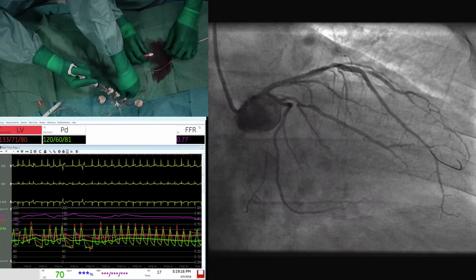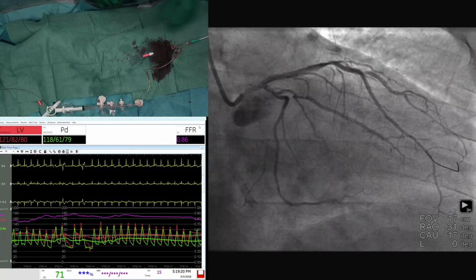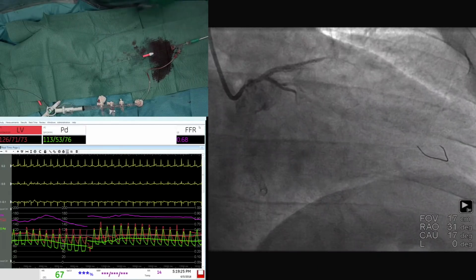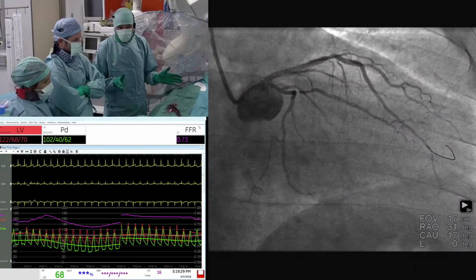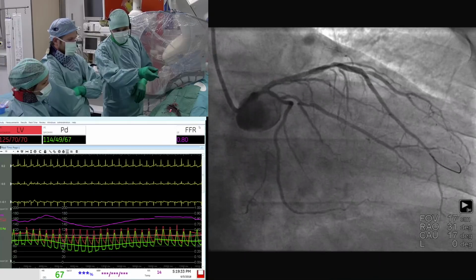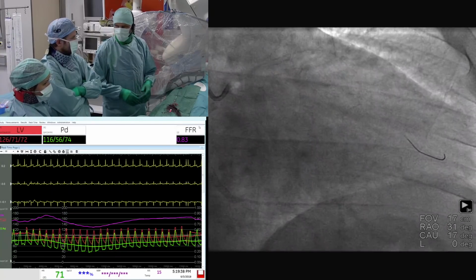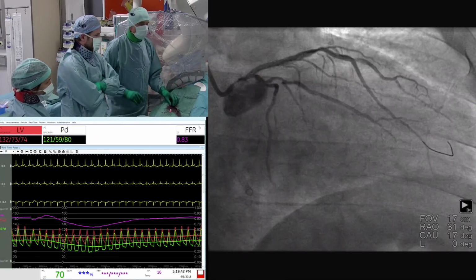Yeah, okay. So we are in the distal part of the LAD. For some reason, the tip of the wire is in a small branch, but really this does not matter at all. That's not the big problem. By the way, look, we have already an information which is key. Gabor just injected 5 cc of contrast, and we have seen briefly a hyperemic response with a Pd/Pa ratio of how much? Yeah, it was 0.75. 0.75, okay, even lower, I think.